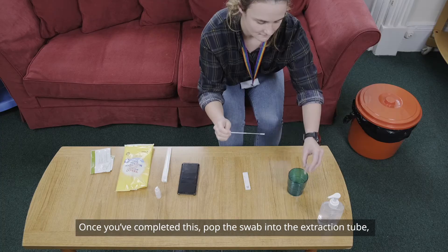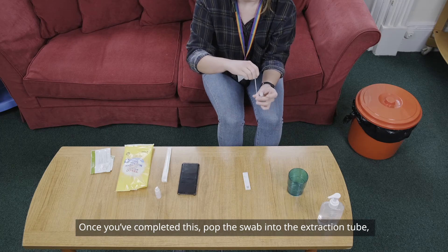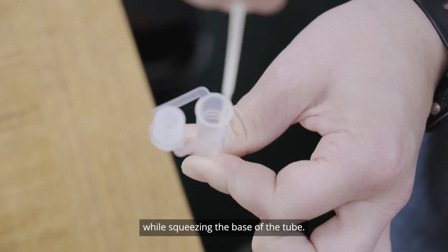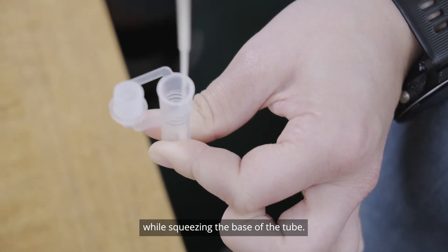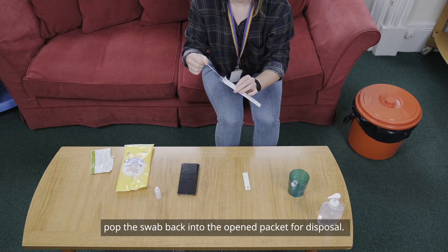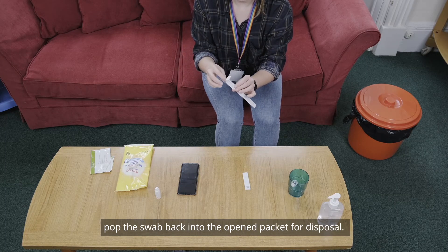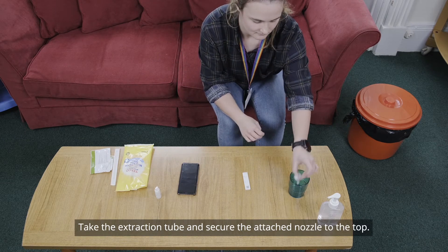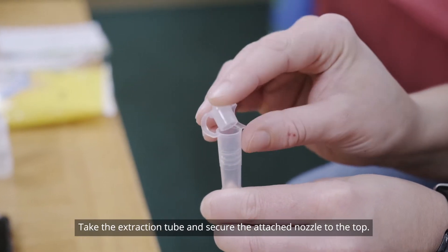Once you've completed this, pop the swab into the extraction tube and rotate it in the fluid for 10 seconds while squeezing the base of the tube. Gently squeeze the extraction tube as you remove the swab. Pop the swab back into the unopened packet for disposal.